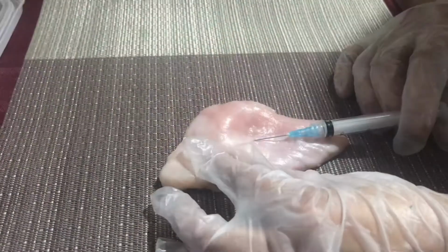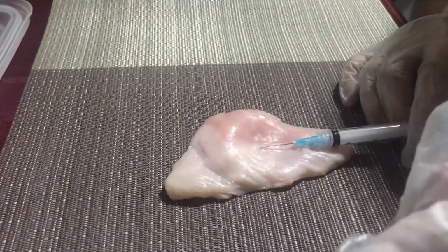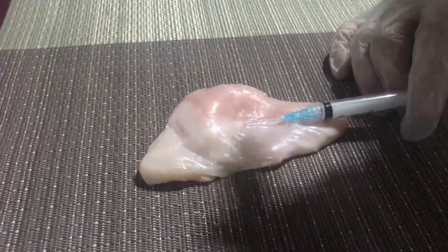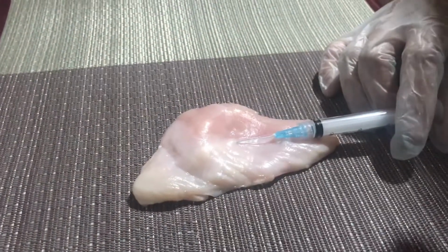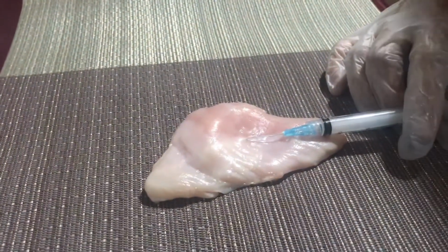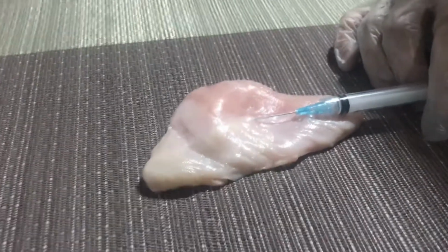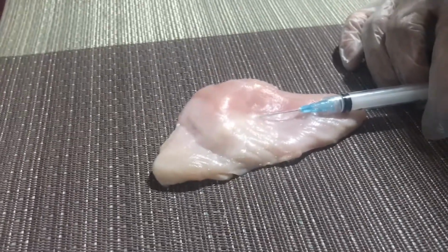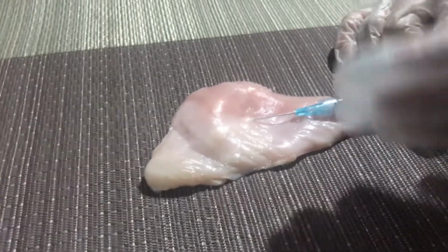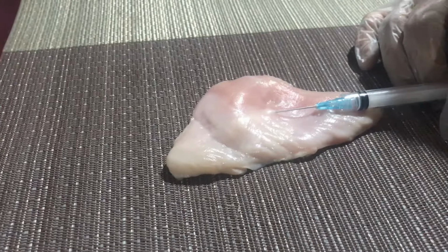So after inserting the medication, next is that we withdraw the needle at the same angle that it was inserted and pat using a dry cotton ball. Don't massage, and place the syringe back on the tray. The rationale for this is that it minimizes tissue damage and discomfort for the patient, and massaging the area may interfere with the test results by spreading the meds to subcutaneous tissue.